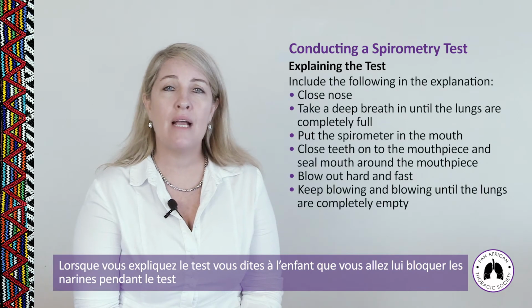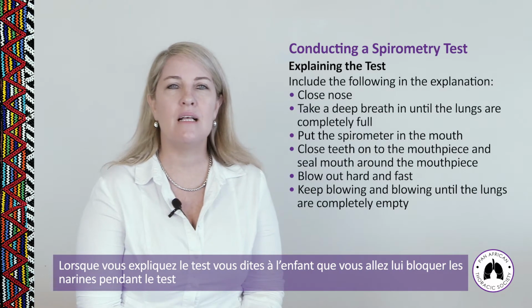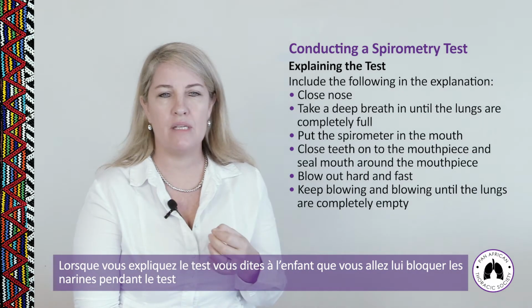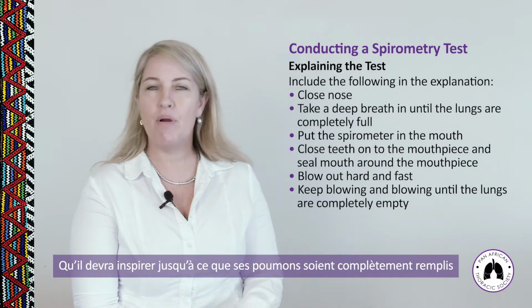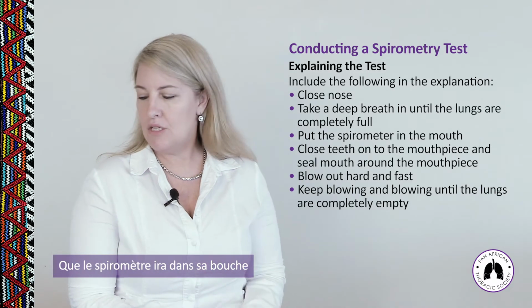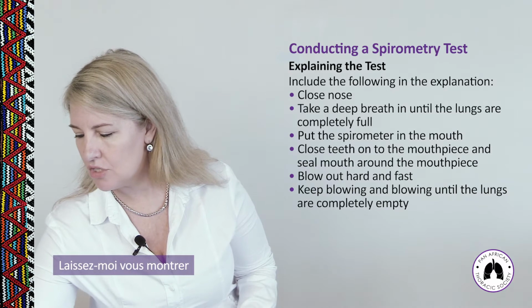So when it comes to actually explaining the test itself, you tell them that you're going to actually physically close their nose when you're testing. They're going to take a deep breath until their lungs are full, full, full. They're going to put the spirometer into their mouth. And I'll get this and show you.